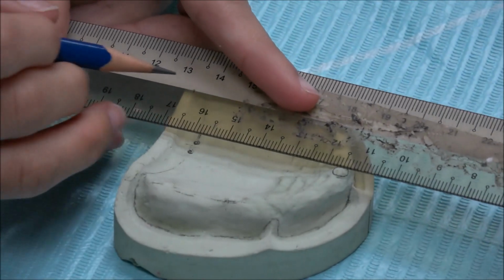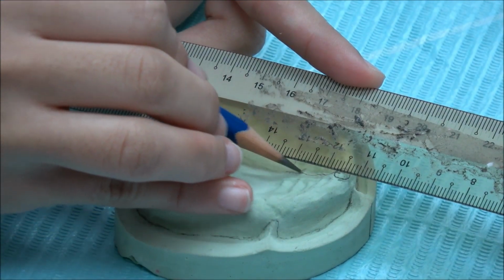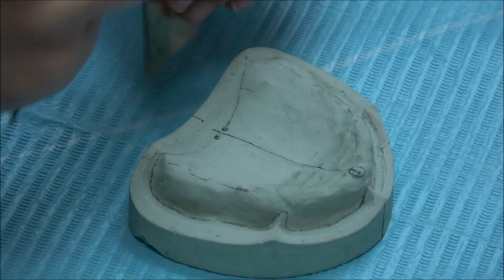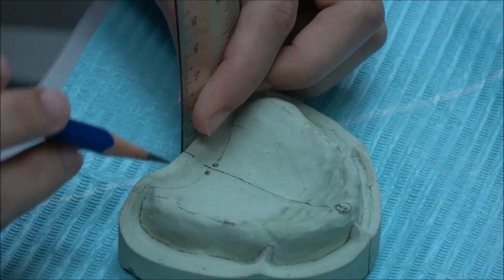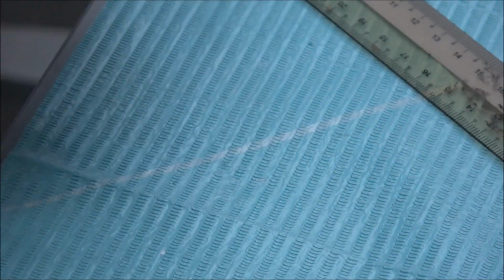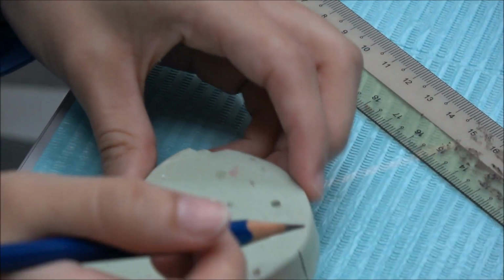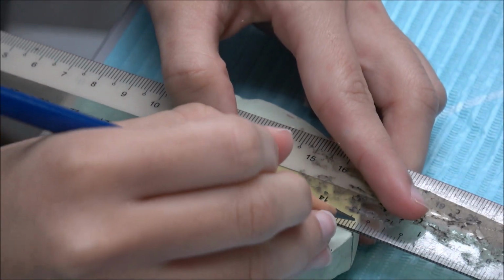In the middle of the line, we draw a line here. Okay, continue to our side base. We draw a line here. Okay, and then we turn to our model base. We join these two lines here. And you see these two lines, we join them using our ruler.